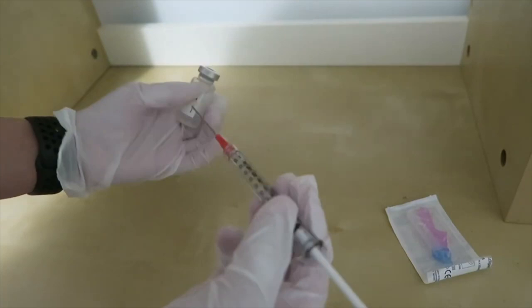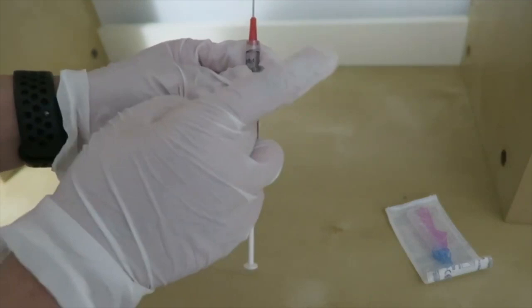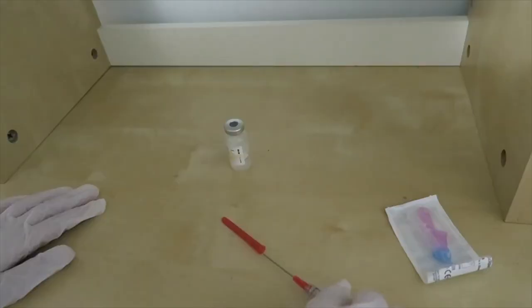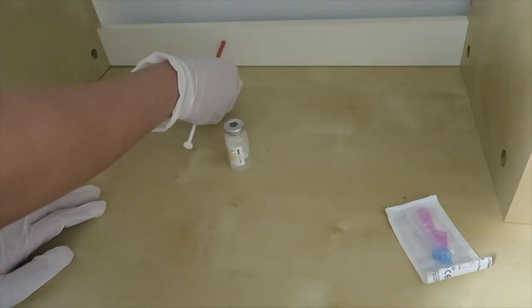So now I have the 1ml of vitamin B12 complex drawn up, and just flicking it to remove any air bubbles from the syringe. With the proper technique, I'm going to recap this needle.